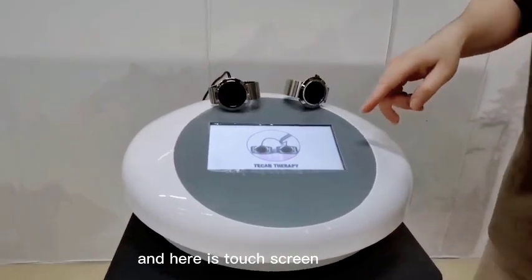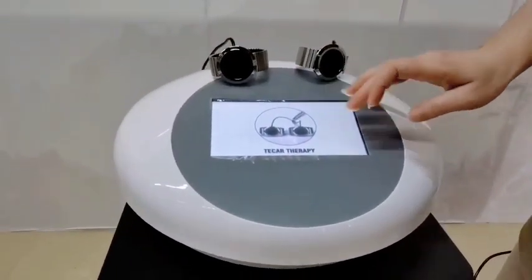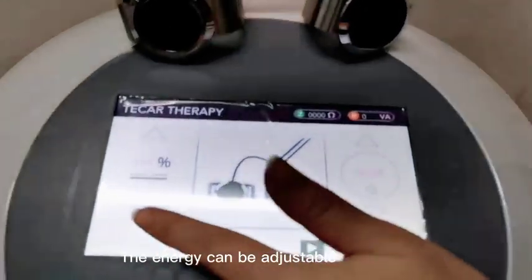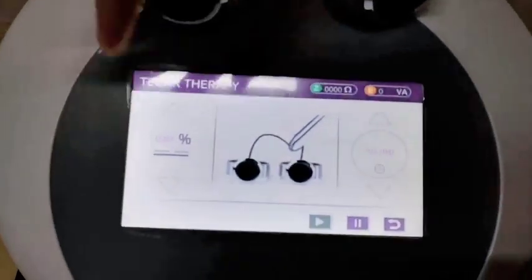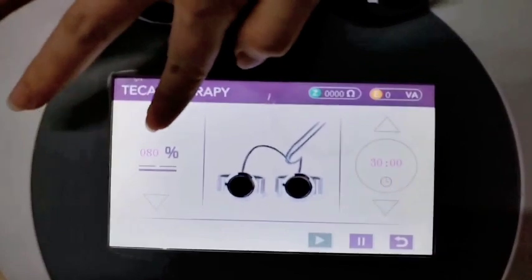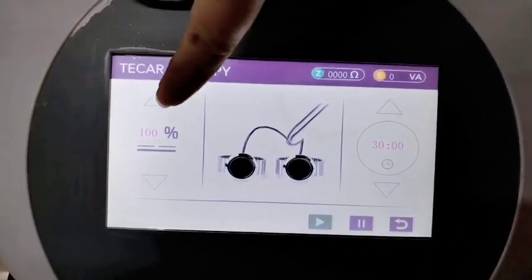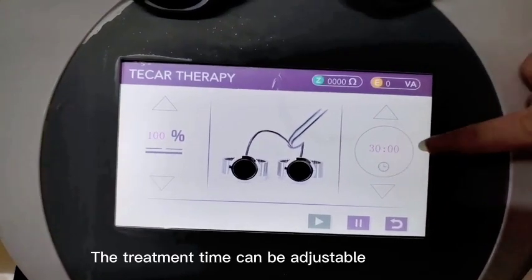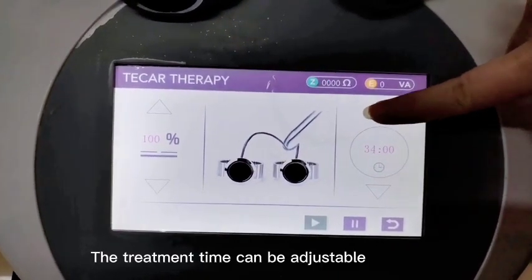Here is the touch screen and we could check this one — it adjusts the energy. It's at 100 percent, which is the max, and this one adjusts the working time.